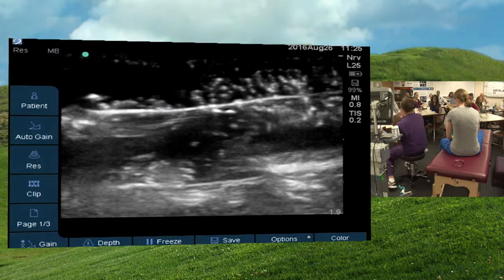There's probably some of you out there who are ultrasound gurus that use direction of flow. I think it has a ton of utility in echo, of course, but I don't do echo. When I use color, I'm mostly looking for pulsatile blood flow. But as you can see, when we looked at Beth's internal jugular vein, it was even a little bit pulsatile. Now it was less so than her carotid. So I'm mostly just looking for, whenever I'm looking at it, is it pulsatile?